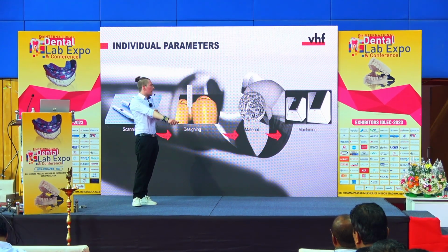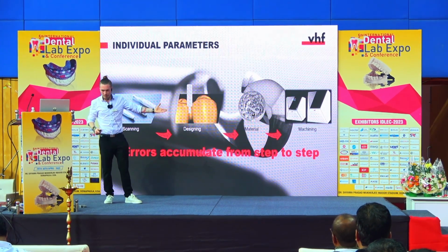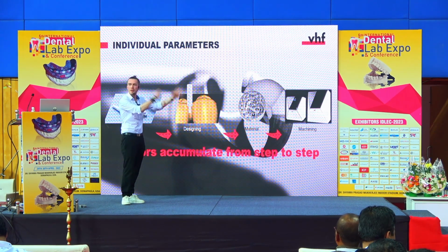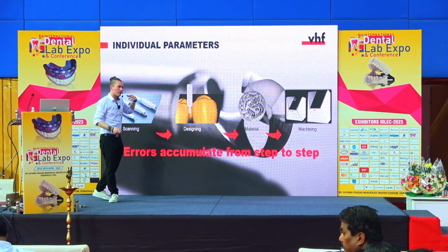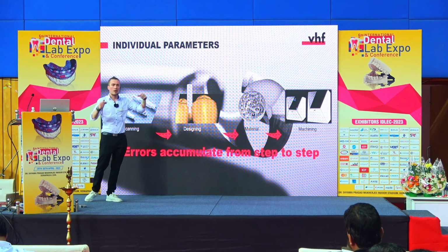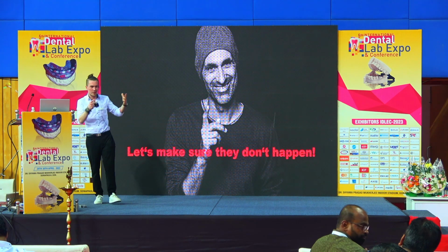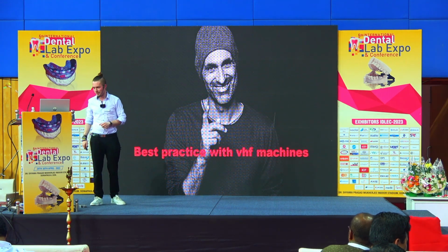And this is why I say the errors can accumulate, and you cannot compensate this error just by throwing more spindle power into the machine. You have to know your workflow, and then you have to see what kind of offset you have in each step, and then how to compensate this. And this is why I said let's make sure that these errors don't happen, and have a look at the best practice.